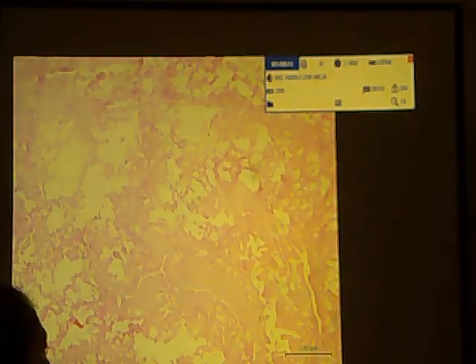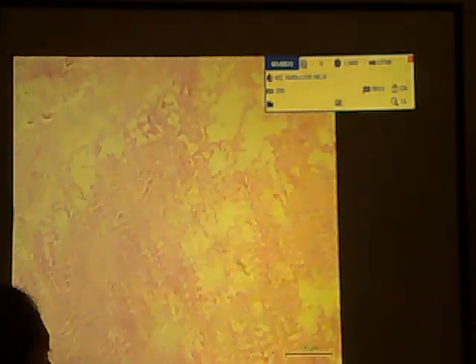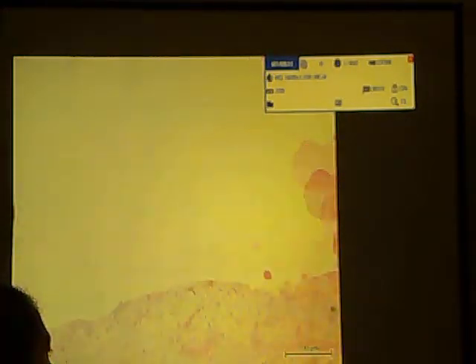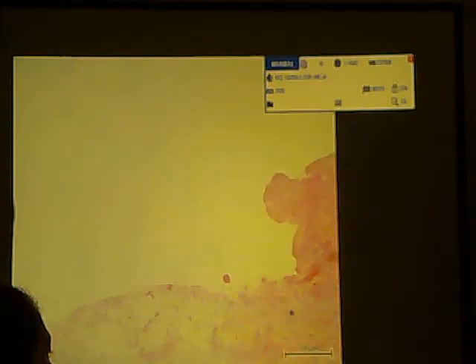Can you identify this? Fibrinous. Yun. So, what's the slide with a fibrinous something? With fibrinous pericarditis. Okay, so you will see this fibrin part. And what's the other term for this disease entity? Have you heard of bread and butter pericarditis? Yes, like a sandwich.